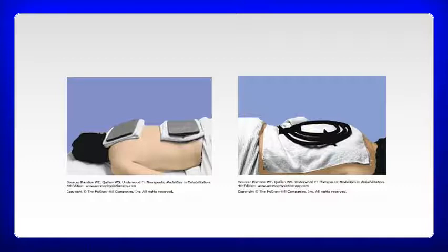Usually, if you're going to see diathermy nowadays, it'll be the inductance technique. So you usually won't see these. However, you may come across them.